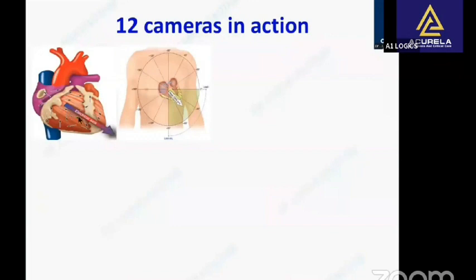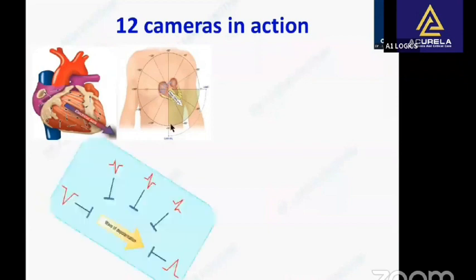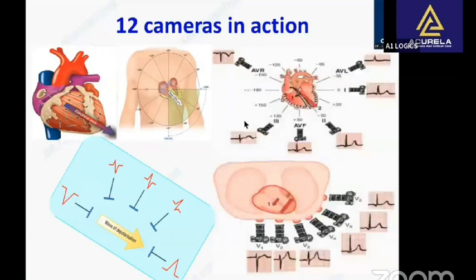The mean electrical axis of the heart is the summation of numerous vectors in the heart, and the mean axis is between 0 to 90 degrees. So when the wave of depolarization occurs in this direction, and there are numerous measuring electrodes, if the wave of depolarization goes towards an electrode, then this electrode records a positive deflection in the ECG. And if the wave of depolarization is going away from an electrode, it records a negative deflection in the ECG. And if the wave of depolarization traverses along these electrodes, we get a biphasic waveform in the ECG. Thus, we have different morphology in different leads.